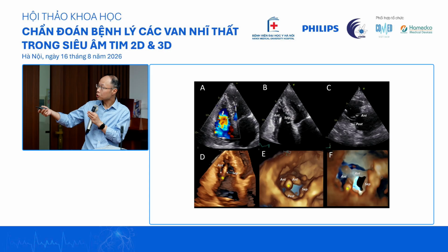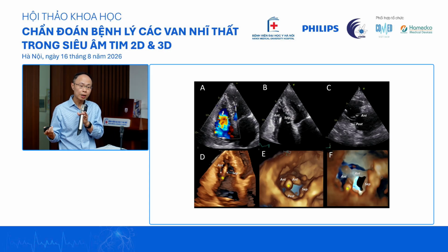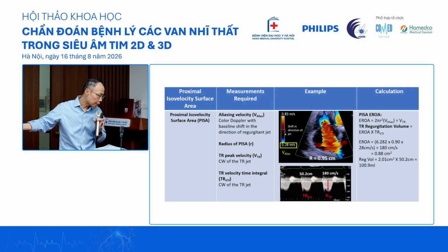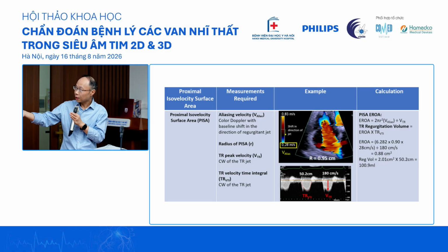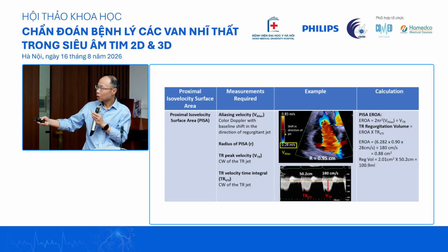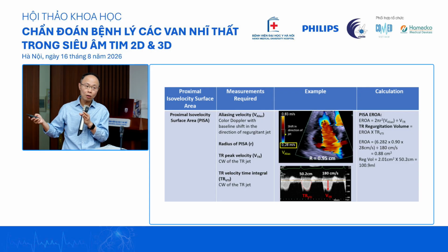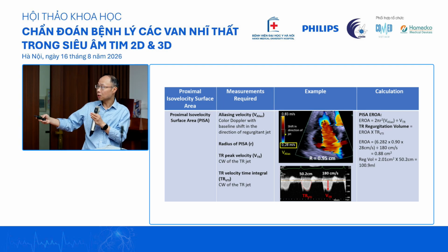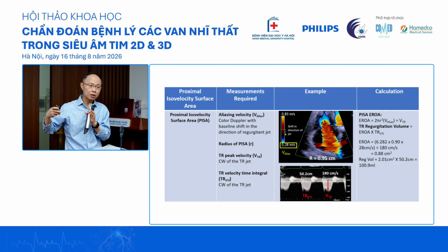And I think to just finish off, these are just some 2D images to supplement all that I mentioned. I think this was already discussed, so in the interest of time, I may not want to go through it again. I just want to say that the vena contracta as well as the PISA are difficult, but they are something that we look for. It's something that is repeatable, and in Rebecca Han's paper, you can see that if you have a vena contracta that's more than 7, it's quite reliable to diagnose severe, and more than 14 is massive.